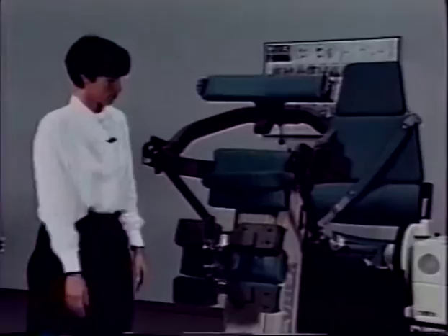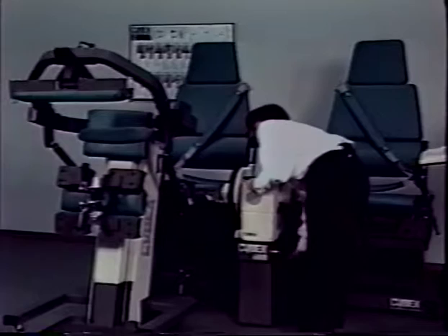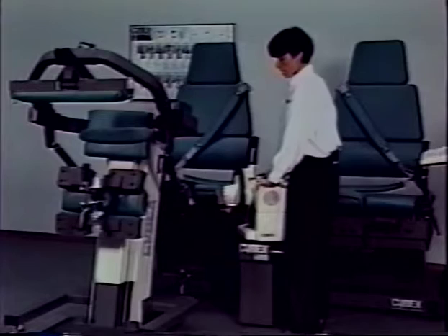Move the input arm on the TEF modular component to the fully forward position. Now loosen the 6000 dynamometer. Rotate the dynamometer towards the TEF modular component and raise the dynamometer to an approximate level of 12.